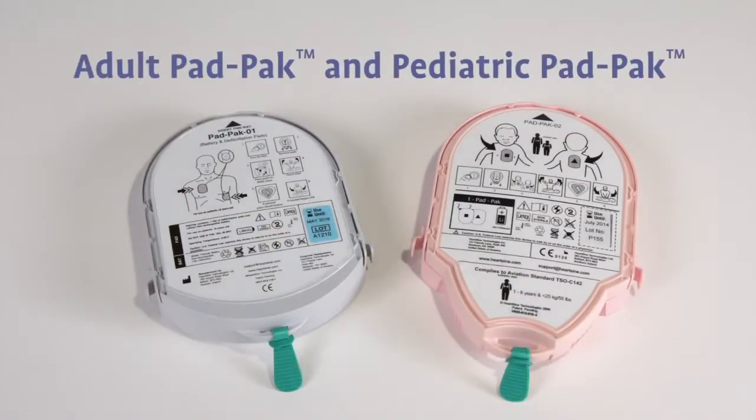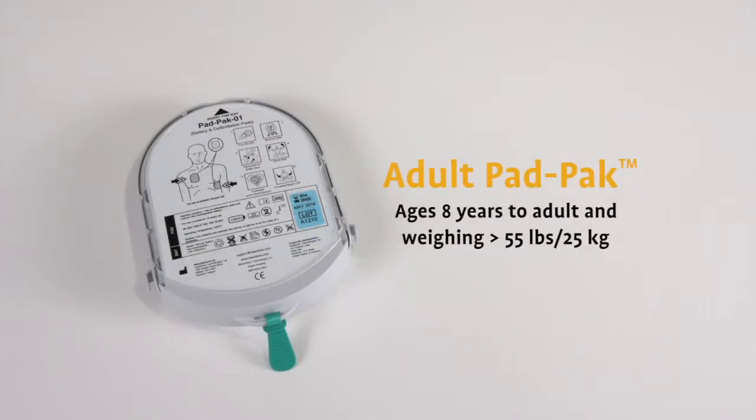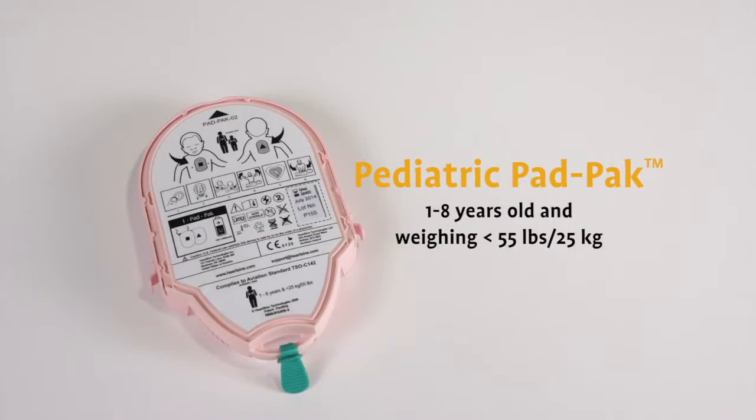Pad packs are available in two versions: one for adults and one for children. The adult pad pack is for patients over eight years old and weighing more than 55 pounds or 25 kilograms. The pediatric pad pack is for children between one to eight years old and weighing less than 55 pounds or 25 kilograms.